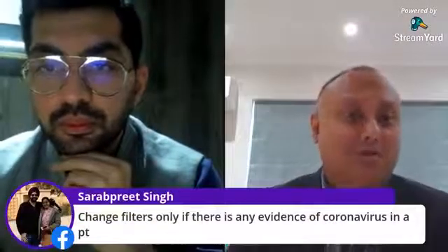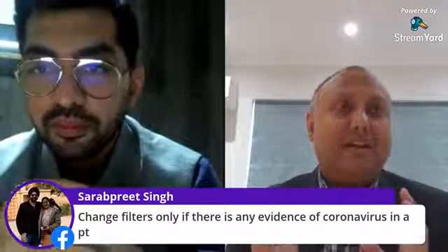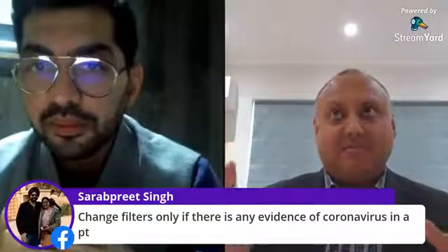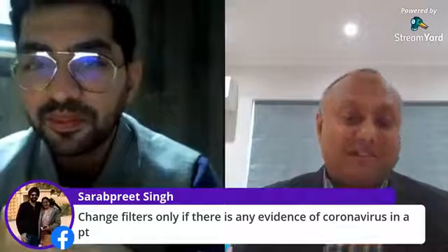Now, revalidation is one thing, sterilization, decontamination. One thing that we tend to have here in the UK is what they call a hydrogen peroxide bomb. I don't know if that's available in India. So we have companies that can come at night. They just release a hydrogen peroxide bomb in the lab. Of course, no one's there, but everything gets decontaminated.